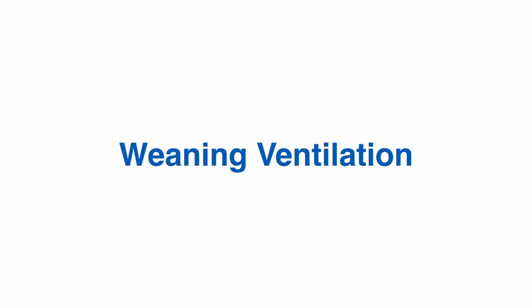Please wean the ventilator if you can. The longer you leave the child on the ventilator, the more risk of complications, both lung and other complications. There is an increased risk of lung injury, ventilator-associated pneumonia, and all the other complications that go with ICU: critical care weakness, central line related infection, clots around lines, ischemic limbs from arterial lines. So you really need to wean the patient as you can.